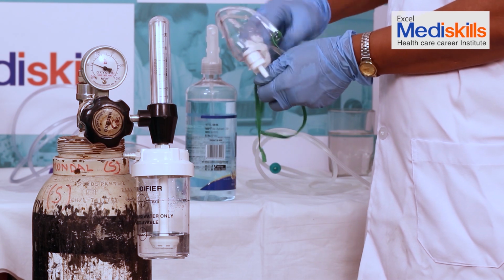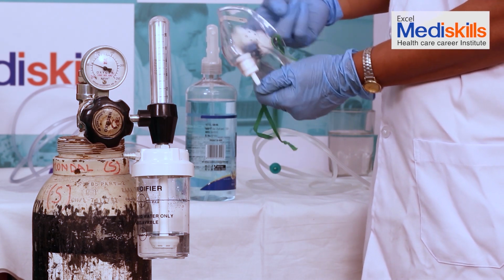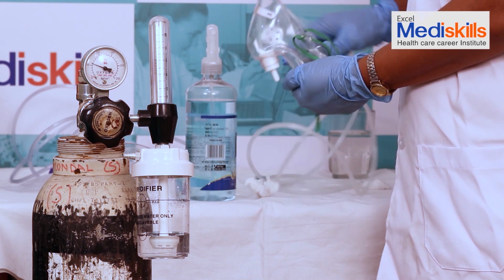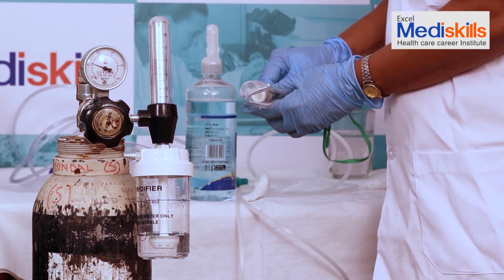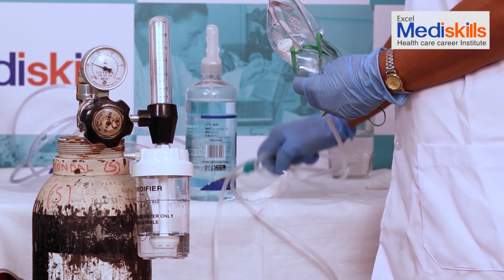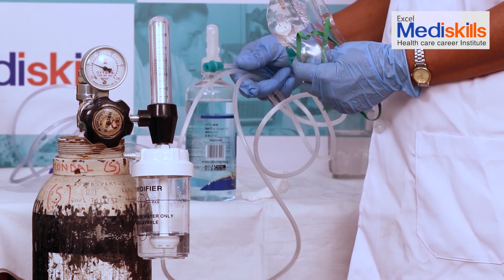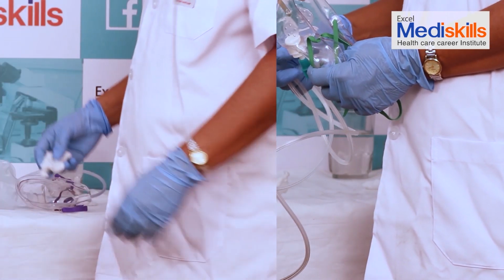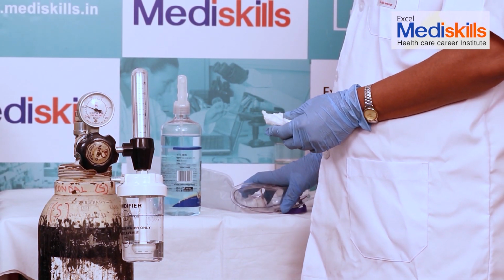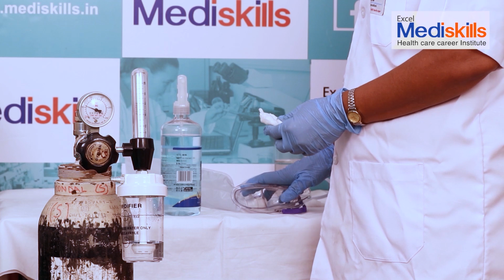It is disinfected, and it has to be disinfected thoroughly. Then we attach the adapter. This side of the oxygen mask is attached to the cylinder. We will now give oxygen to the patient. We will disinfect the bag mask in the same way and then use it with the patient.